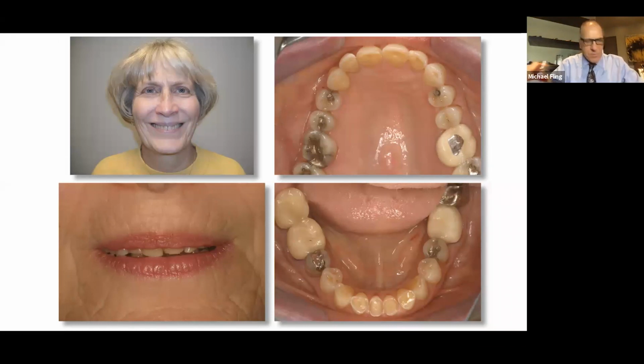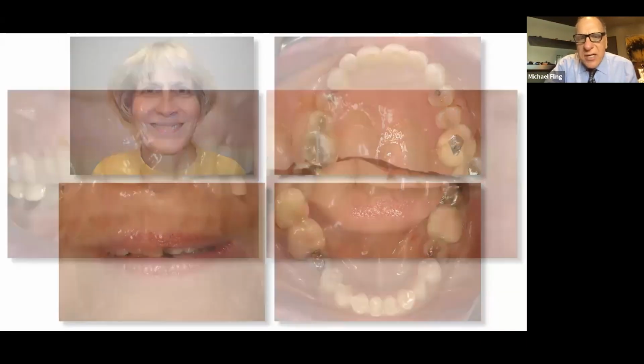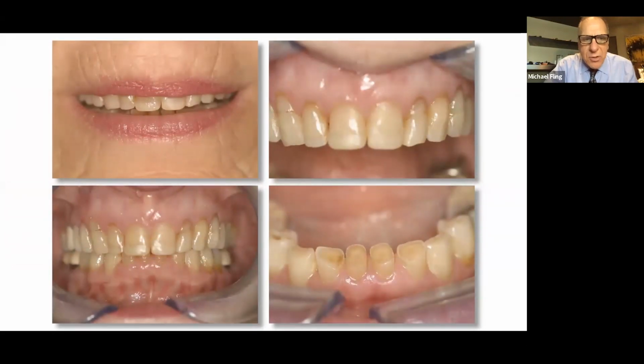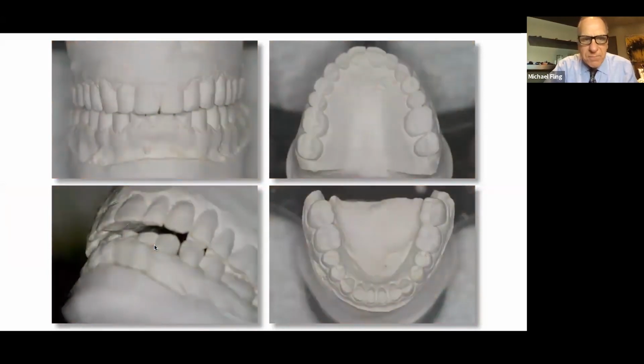This is a lady that presented, and we had ortho done because she had significant dental alveolar extrusion. We had to create space for restorations in the anterior, so we had all the intrusion done. She wanted things to be more aesthetic. Here she is. You can see, you don't even see free gingival margin heights here. And so they end up doing some intrusion. Here you see the upper anterior. There's where we've added composite. We're going to end up restoring all of this.